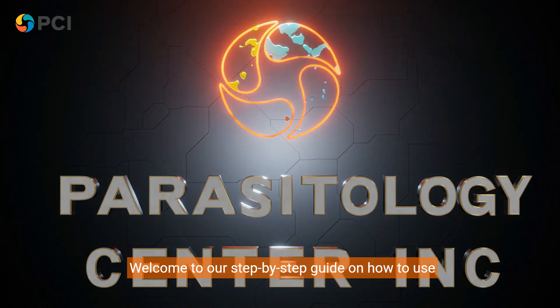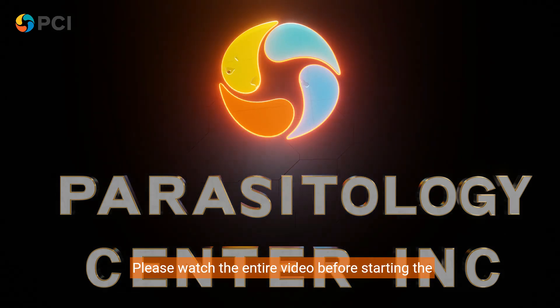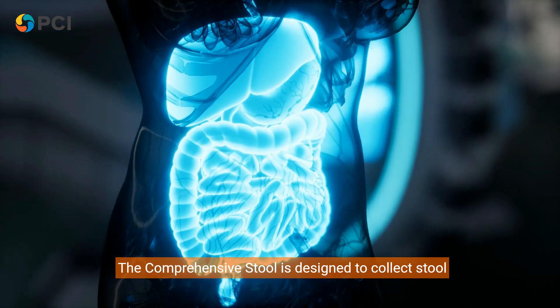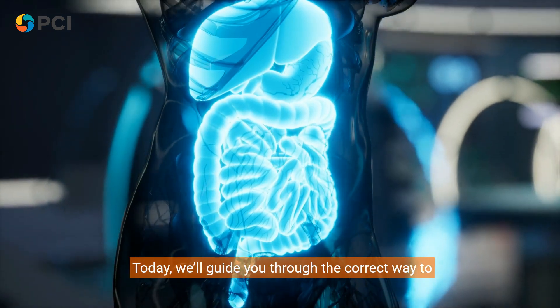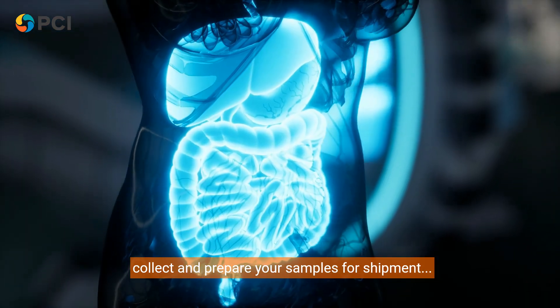Welcome to our step-by-step guide on how to use the Comprehensive Stool Test Kit. Please watch the entire video before starting the process. The Comprehensive Stool Test is designed to collect stool samples to test for various gastrointestinal issues. Today, we'll guide you through the correct way to collect and prepare your samples for shipment.